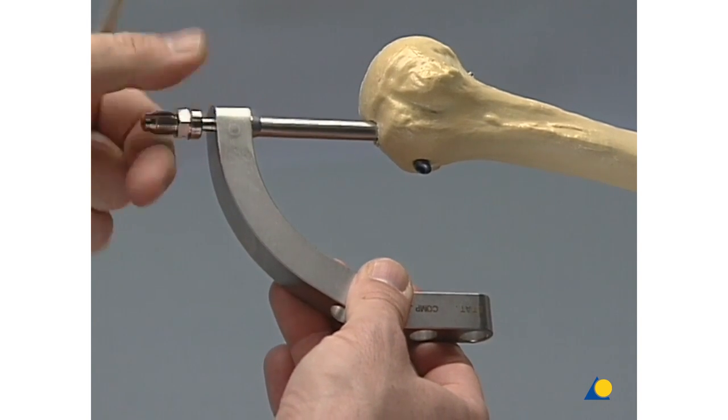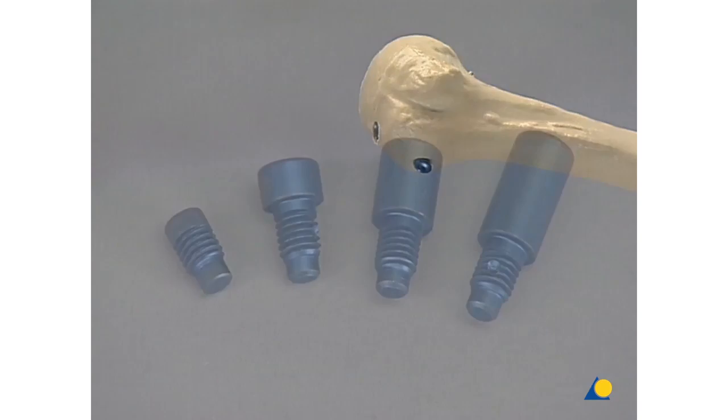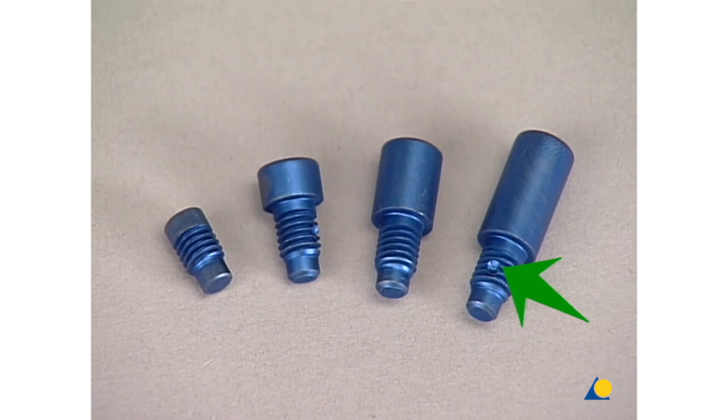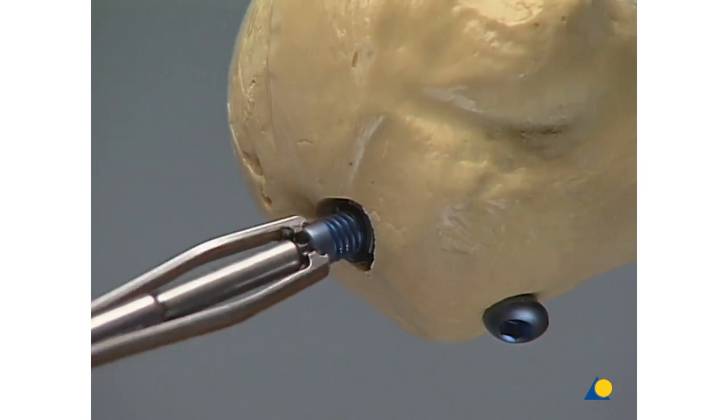To prevent bone ingrowth and to adjust the nail length after insertion, choose one of the end caps with 15, 10, 5, or 0 mm lengthening. Note that the final portion of the thread is scarified to prevent loosening. This will produce additional resistance as the end cap is screwed into the nail. Here, a 0 mm end cap is inserted.